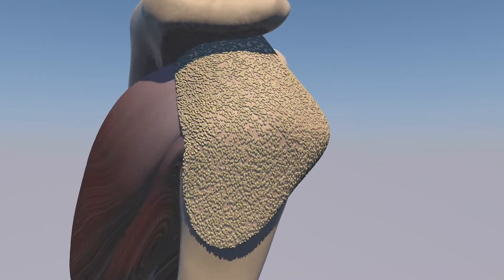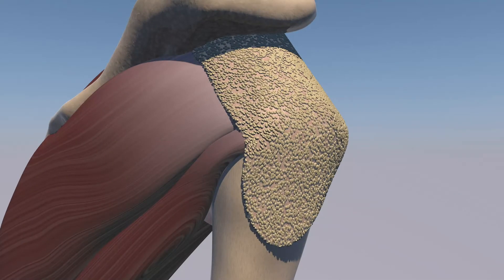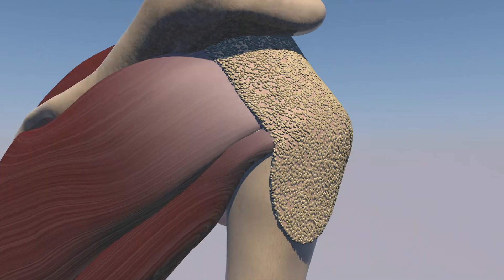Here's essentially a normal subdeltoid bursa with peribursal fat around it. You can see how thin it is and it just kind of laces over the rotator cuff musculature and the proximal humerus.